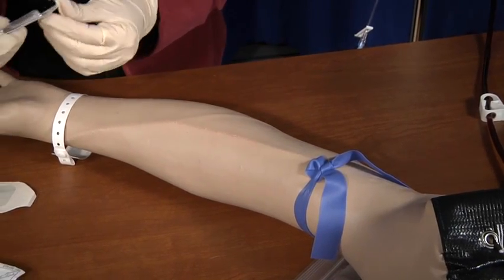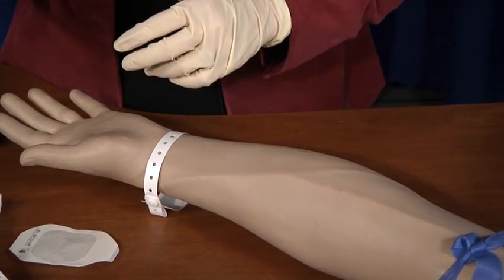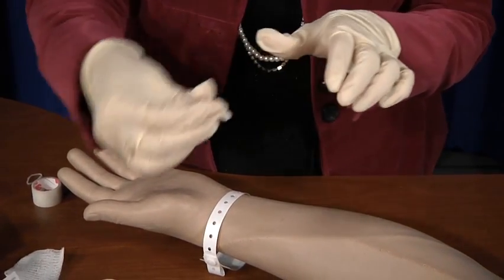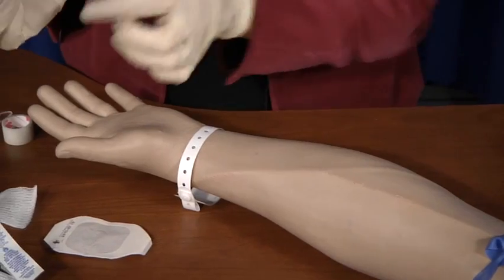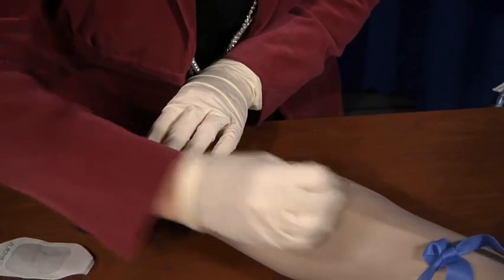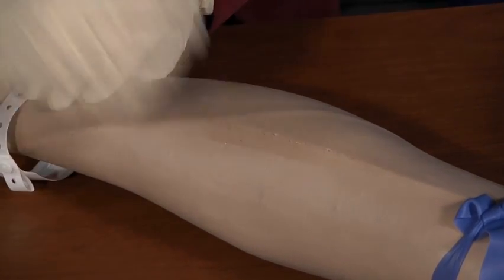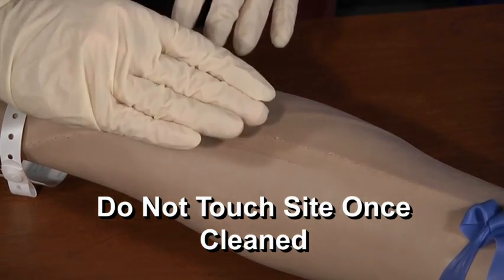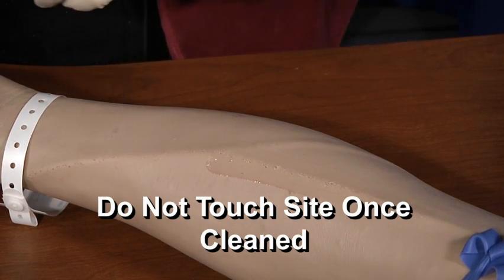This is chlorhexidine. This is our cleaning solution. And there's different types. You can have alcohol, or they may have chlorhexidine. Most hospitals have chlorhexidine. This one in particular, you pop. Get the gauze in the end wet. And per manufacturer's suggestion, we're going to use friction back and forth. And we'll let that dry. Now, if you have an alcohol, you're going to start in the center, and you're going to do a circular motion outward, about 2 inches.